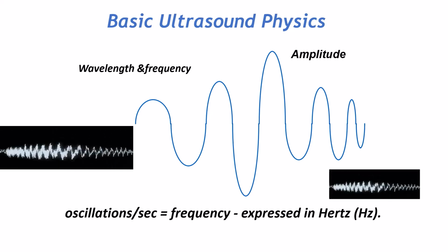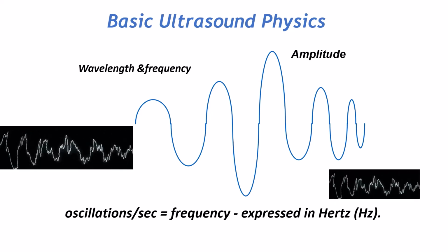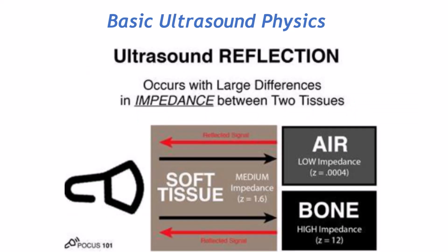The ultrasound waves travel through tissue by displacing matter, expanding and compressing adjacent tissue. This generates an ultrasonic wave that is attenuated by the tissues that it encounters. The transducer emits a sound wave and receives the echo from the interaction of the sound wave with tissue.